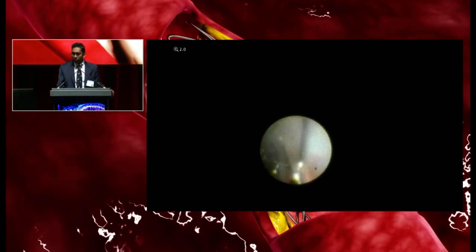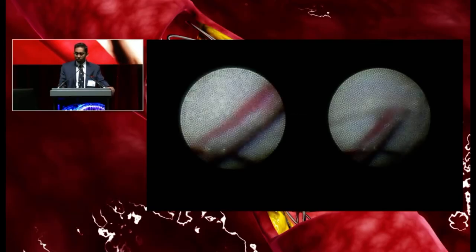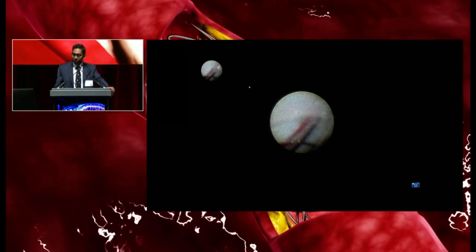Here's a video. As you go back and forth, you can kind of see in perspective what's going on there. That's a fresh stent that's been placed, and then what you see kind of ghosted there is an intimal layer over the prior stent. Here's another case. This is a dural venous sinus injury with a balloon and a small intimal injury that was not detected by DSA. It is detected here with the microangioscope. This is actually Vitor's case that he provided to us from St. Mike's. And this provided us useful information that led to subsequent stenting.